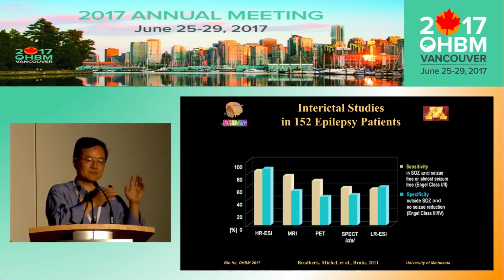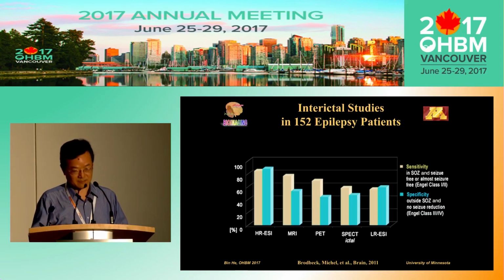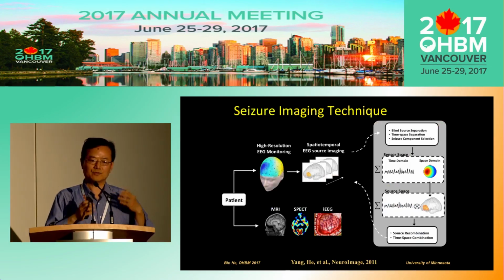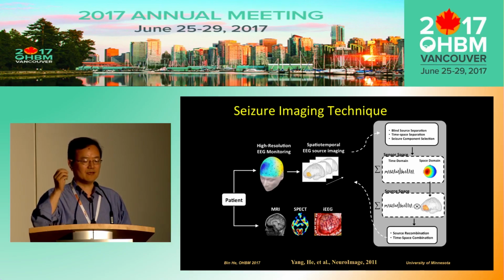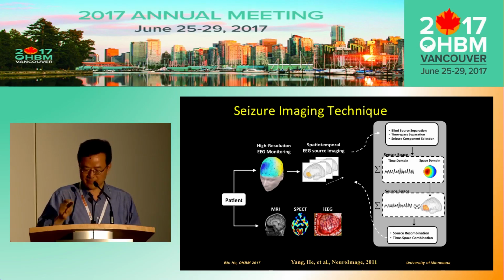And this is a large cohort of epileptic patients, which I think illustrates what kind of clinical utility this approach could have. Now, what I do want to touch on is that even though the work has been established beautifully that we can image the interictal source from high-density EEG, as far as epilepsy is concerned, our ultimate goal is to image the seizure source, because we want to cure the patient and make them seizure-free.